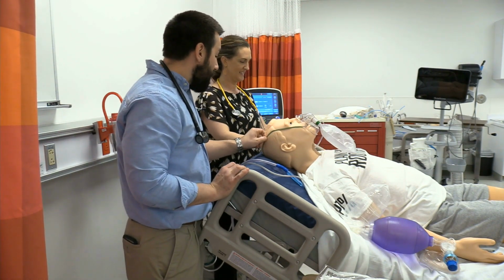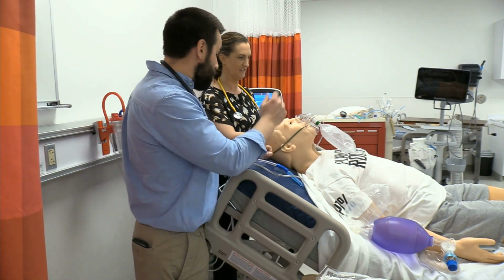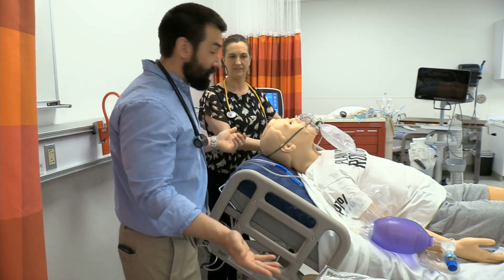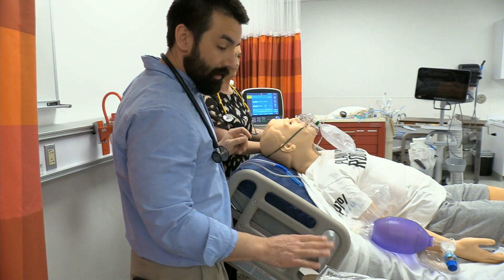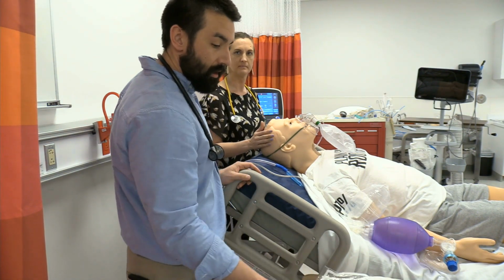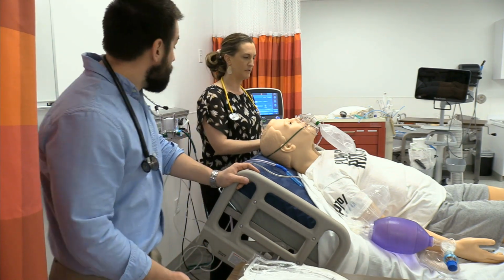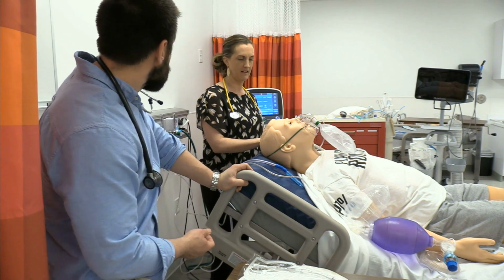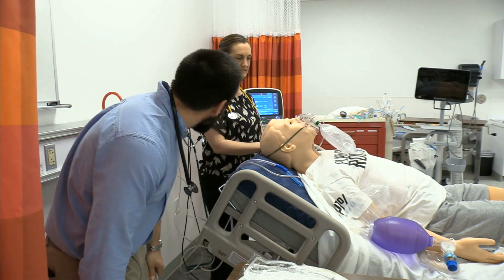Absolutely, yes. So I had this patient spontaneously breathing on this non-rebreather. I got suction, got you your lovely Miller 2 there. I decided an 8.0 tube would be the route to go. I think we got everything ready here. We're kind of short-staffed and don't have nursing, so I was the one drawing up the drugs as well. I had a bunch here. Yeah, let's do it.